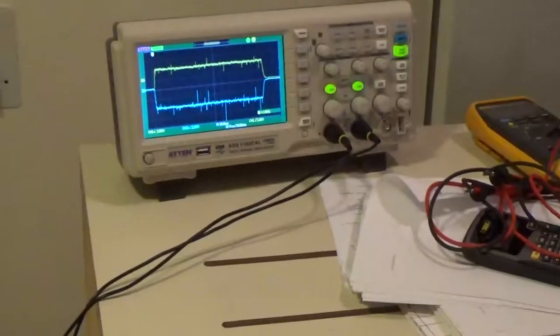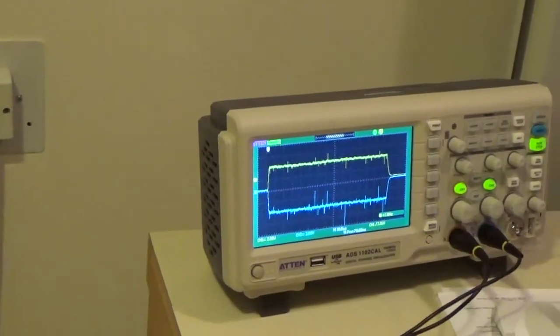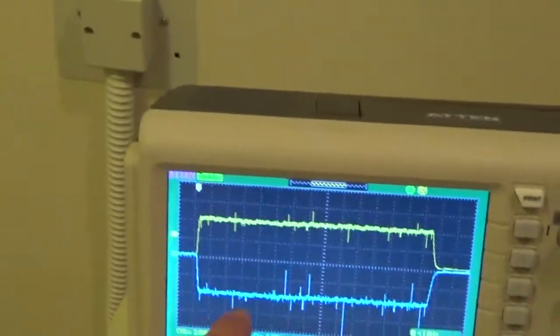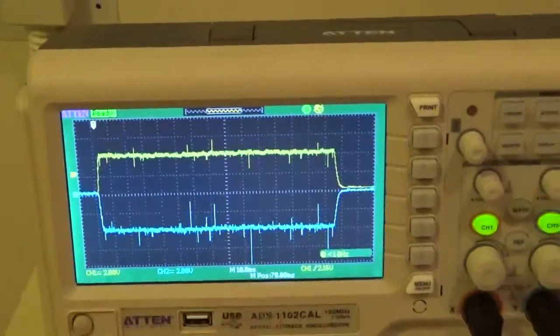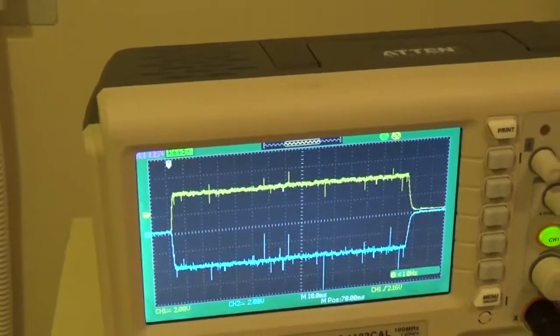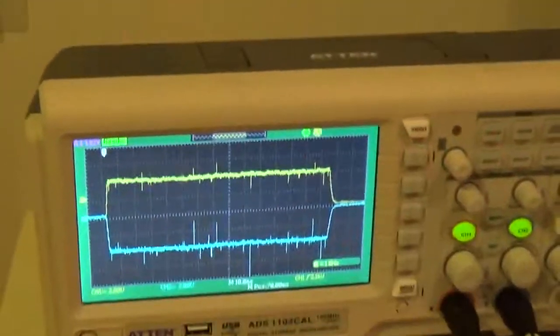Now, okay. CPI. Can I do it with that? The CPI does have that. Because the problems we ran into with MXR is the guy's not selecting the tube. Can his test tell me if the tube is damaged? Well, yeah. A little. Here's the thing. Let's look at this a little bit. First of all, this is just noise, and it's picking it up. Ignore those weird looking lines. That's where looking at a digital scope versus the analog scopes with storage differs. They're not as susceptible to that.